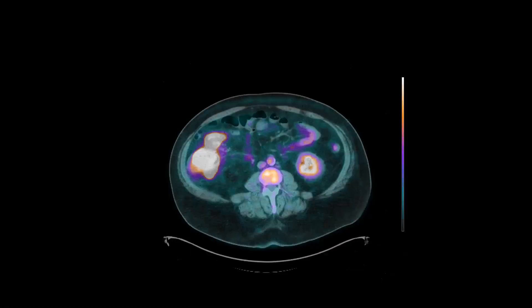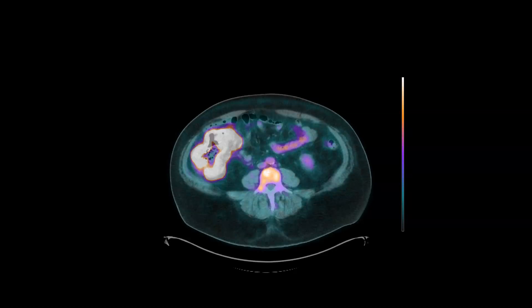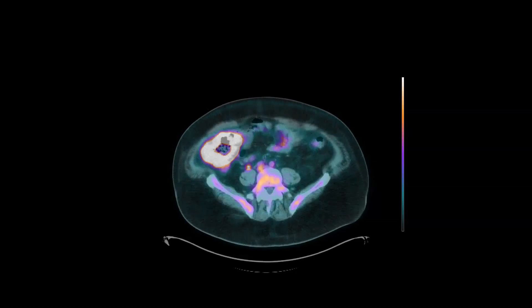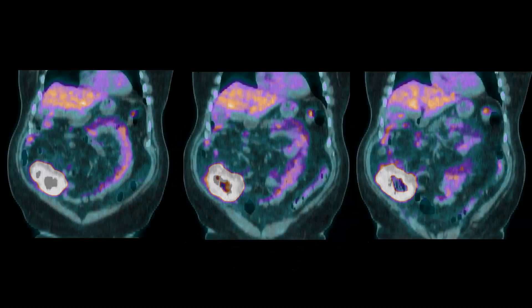This patient subsequently had an F18 FDG PET CT. As expected, the tumor is markedly FDG avid, as lymphoma typically is — particularly large B-cell lymphoma. Notice the circumferential avidity, very marked compared to the adjacent bowel. This coronal image series shows the adjacent bowel is much less avid than the involved segment.